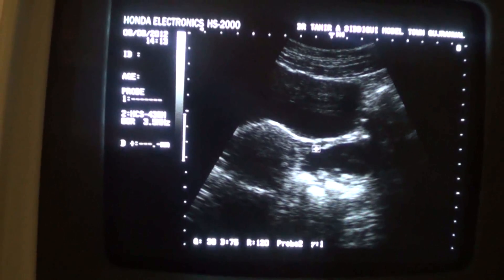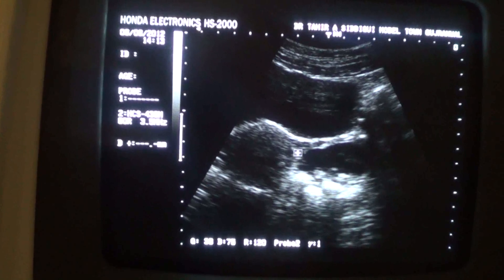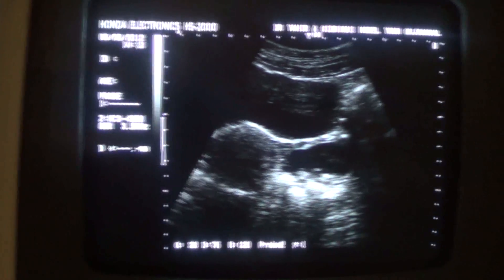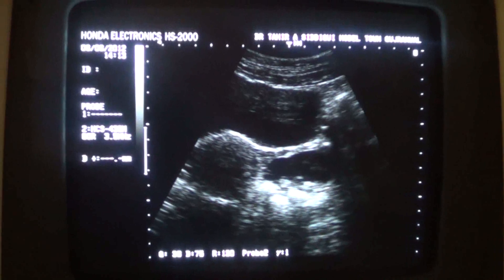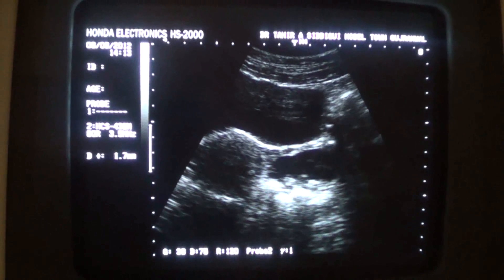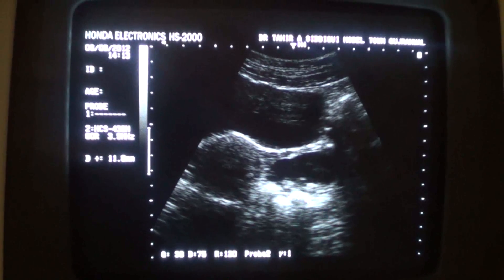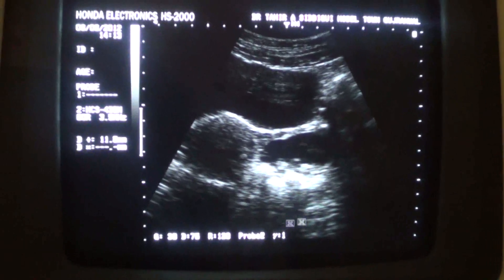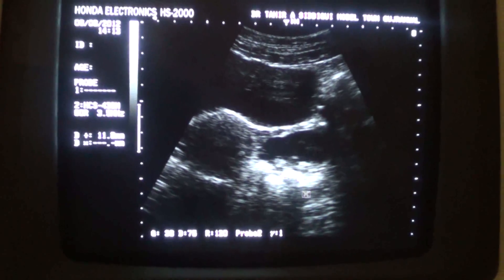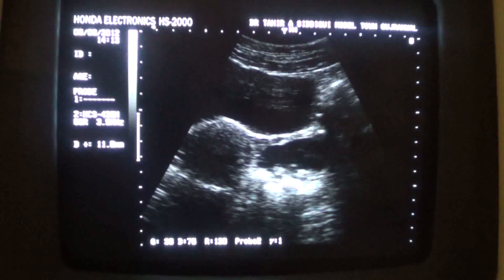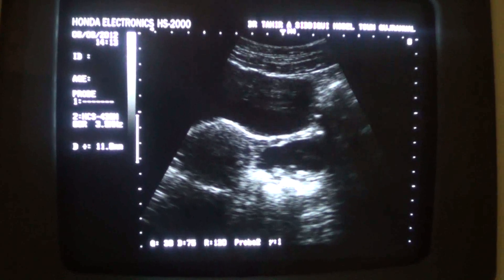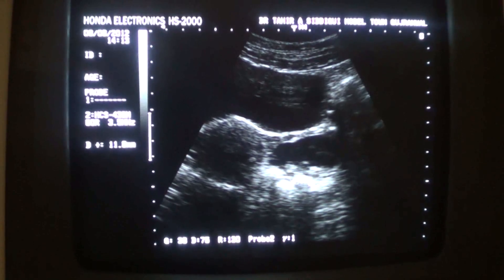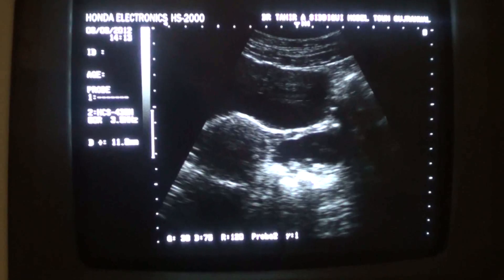This is the thick wall and these are the calcifications — two, three, four — the largest of these measures approximately 11.8 millimeters. Note the degree of posterior acoustic shadowing from the calcification. So this is a short segment study regarding a retention ovarian cyst with dependent region calcification. Thank you.